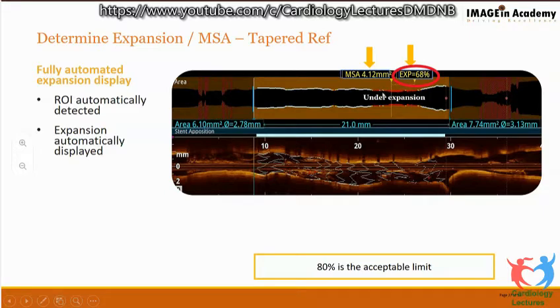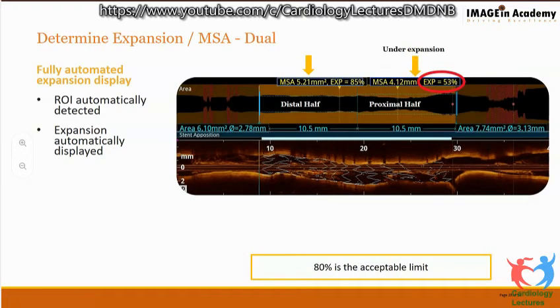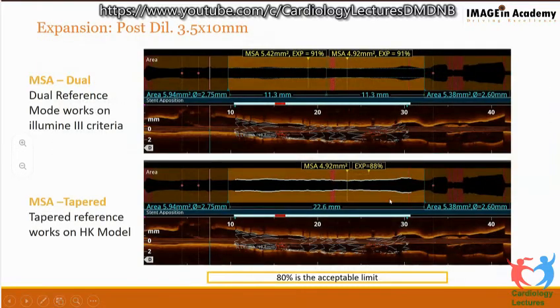The machine is going to mark this in the lumen profile. And if the under expansion is considerable, the red layer will be much larger. So now we've used the dual method just for the sake of training, where the vessel is divided into two halves, the proximal half and the distal half, using those standards. There was considerable under expansion here. So one needs to dilate; the stent was post-dilated.